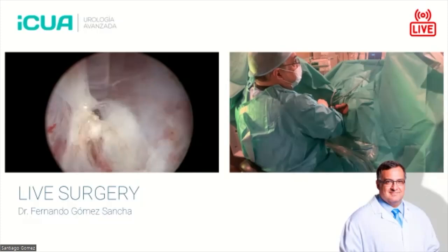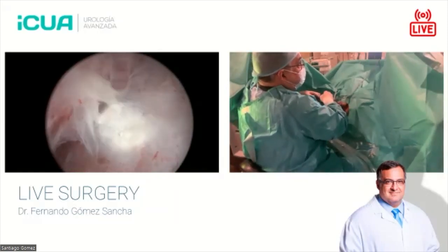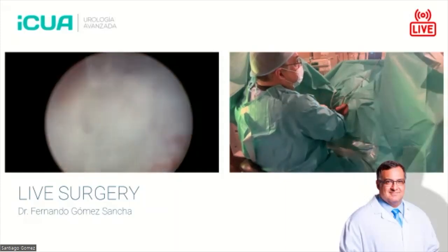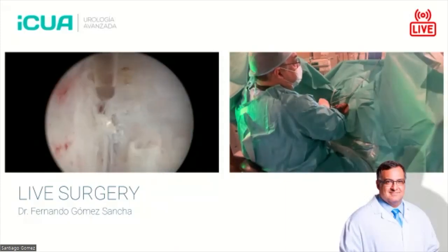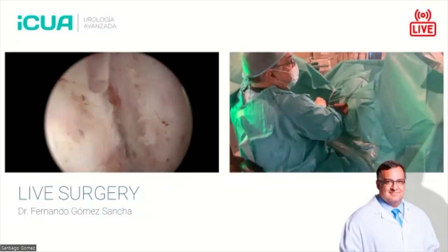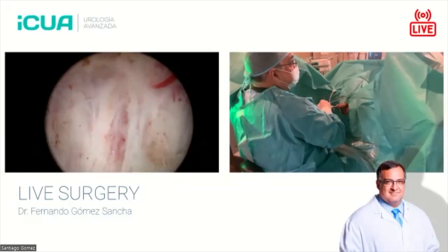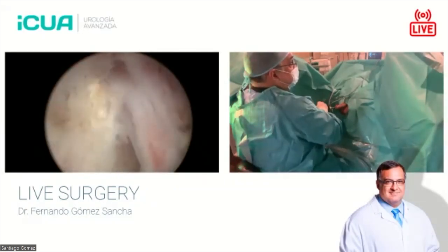Here we are coming up a little bit. You see, this mobilization is paramount if we want to get towards the 12 o'clock area. But you see here, I'm stopping. I'm not going further up because when I come out, you see, this is still attached. This is the apical attachment. So I want to cut the apical attachment first.